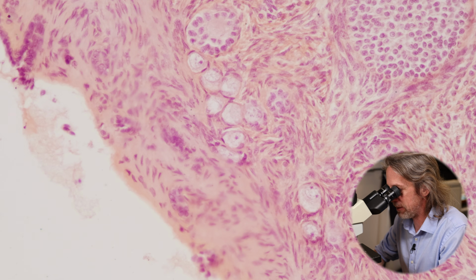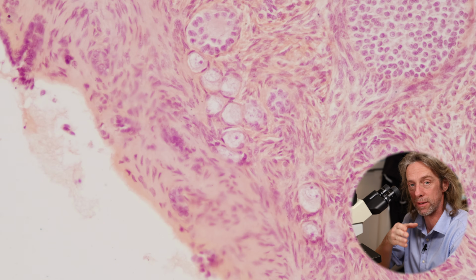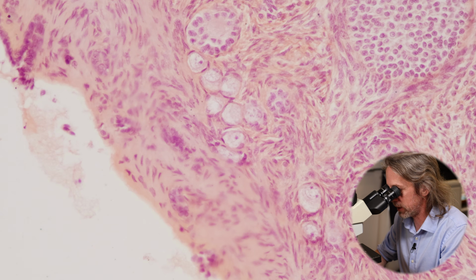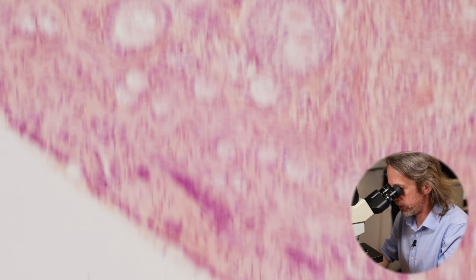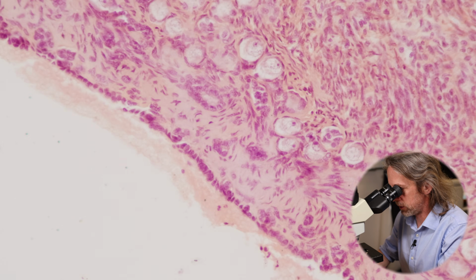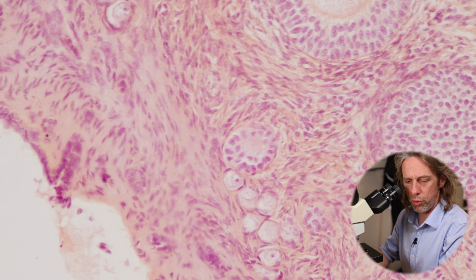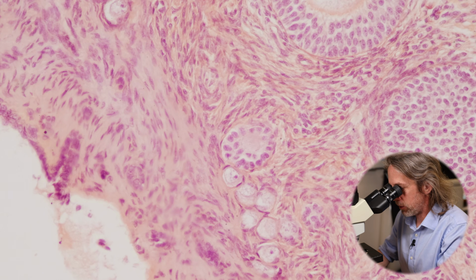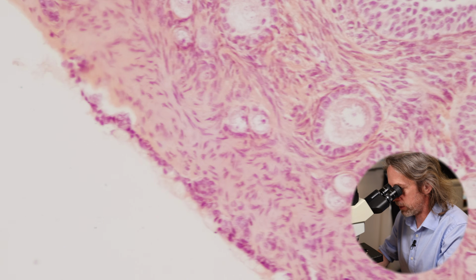So there are many, many primordial follicles, and this is that primary oocyte fixed in that first stage of meiosis. So there are lots of these primordial follicles around, right? And they're around the edge. And then we can see, as we're moving kind of towards the middle of the ovary, there's one there as well. That's quite a good one.